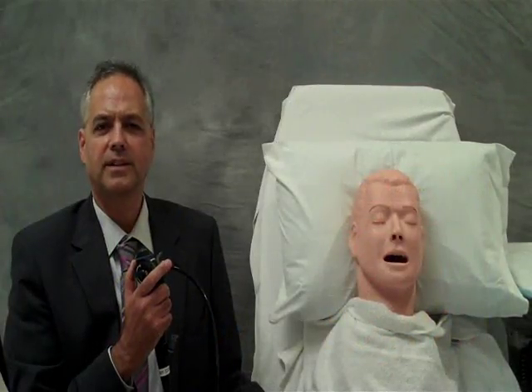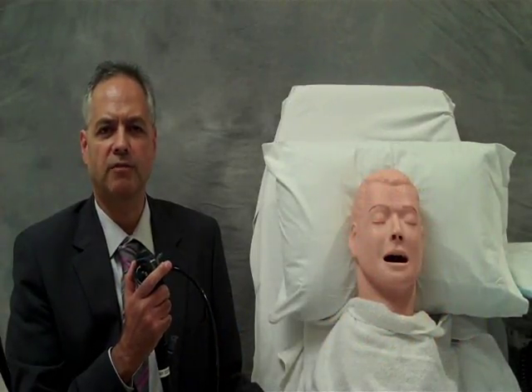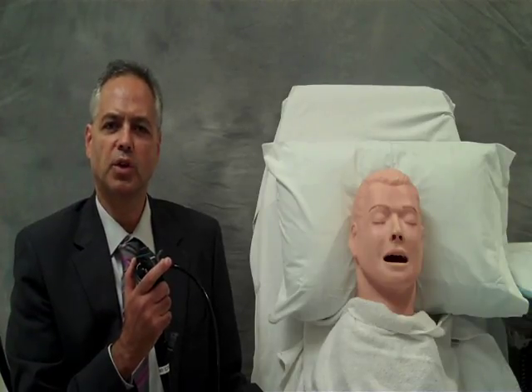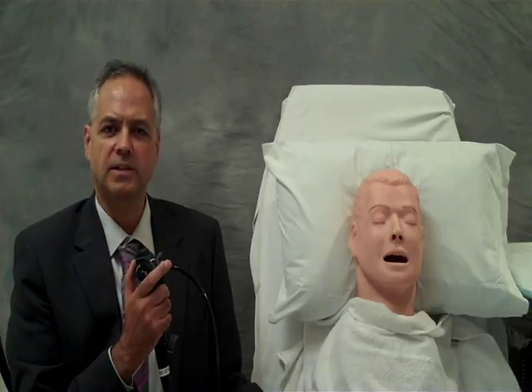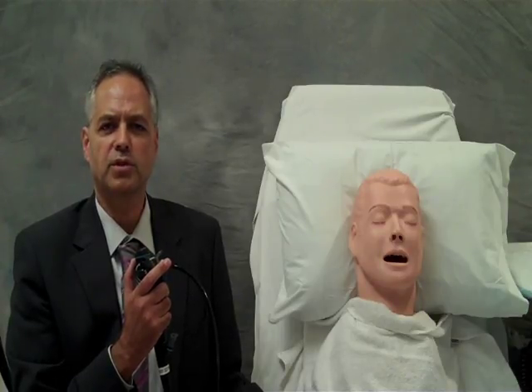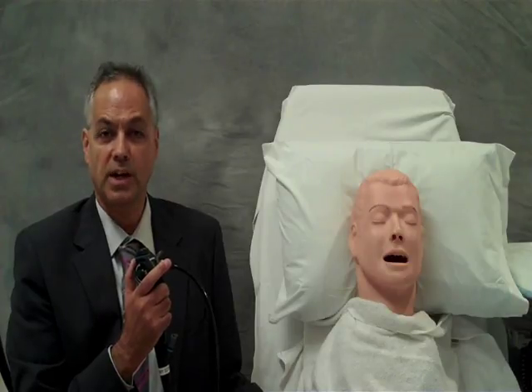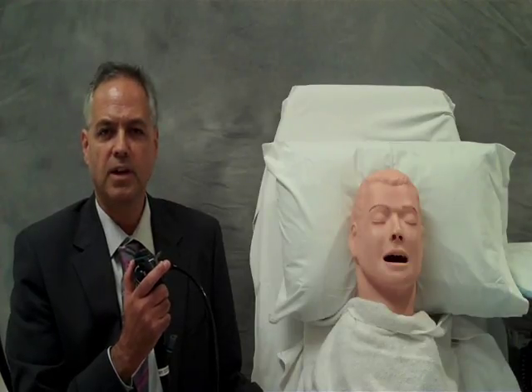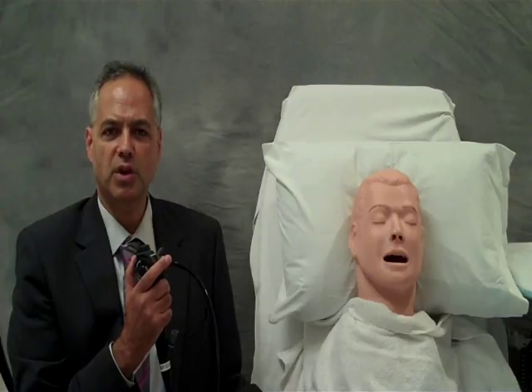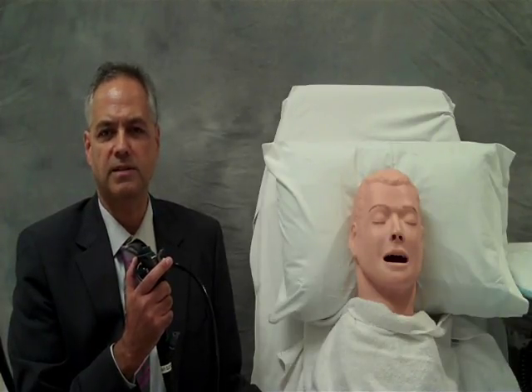My name is Henry Colt. Today my team and I are going to demonstrate a series of bronchoscopy step-by-step exercises. Just as one learns to play tennis or golf in stages, or learns to play a musical instrument step-by-step, one can also learn bronchoscopy using this systematic approach. We've thus deconstructed bronchoscopy into a separate group of exercises.